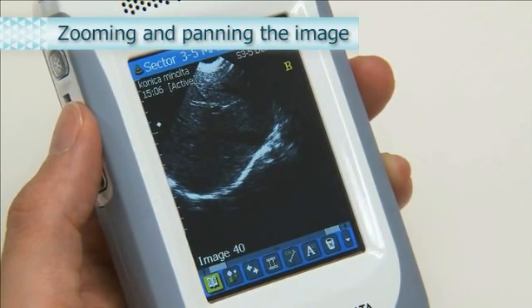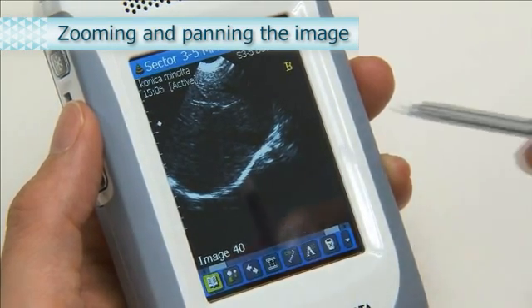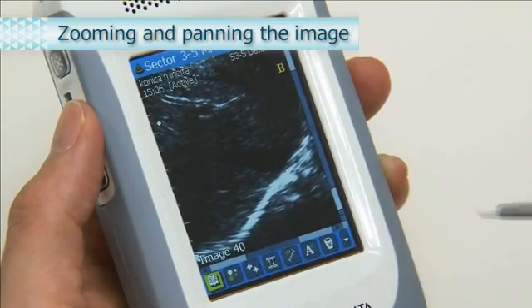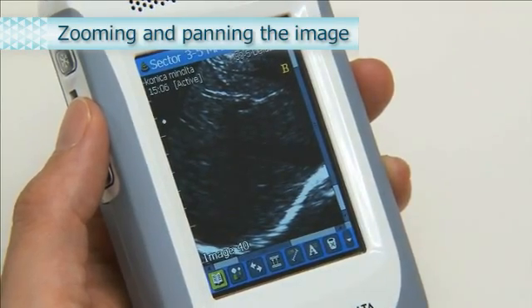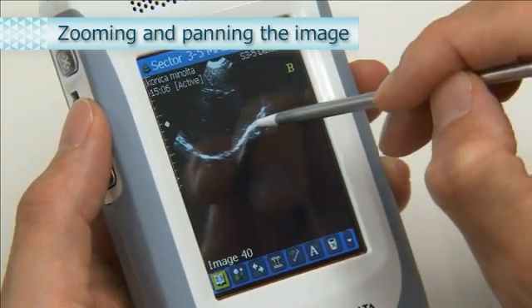When an image is frozen, the view can be magnified, reduced, and moved. Move the stylus pen in the clockwise direction to magnify the image. To move the view, drag it by moving the stylus pen. To reduce the image, move the stylus pen counterclockwise.